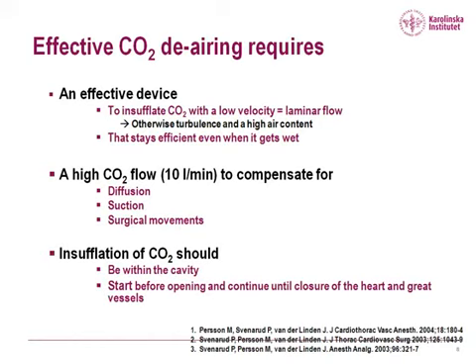Effective CO2 de-airing requires an effective device to insufflate CO2 with a low flow velocity so that you have a laminar flow. Otherwise, if you have a jet, you get turbulence and high air content in the cavity. And the device has to stay efficient even when it gets wet. You need a high CO2 flow to compensate for diffusion, the suction devices, and the surgical movements in the cardiothoracic cavity. And the insufflation should be within the cavity and start before opening and continue until closure of the heart and the great vessels.